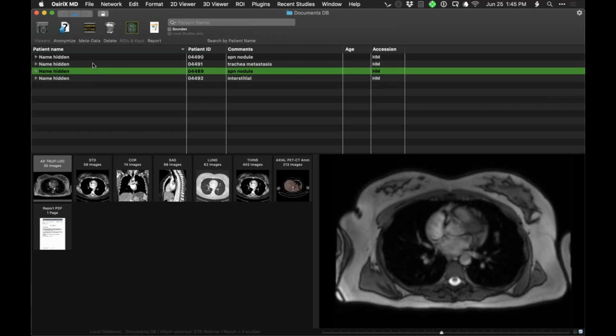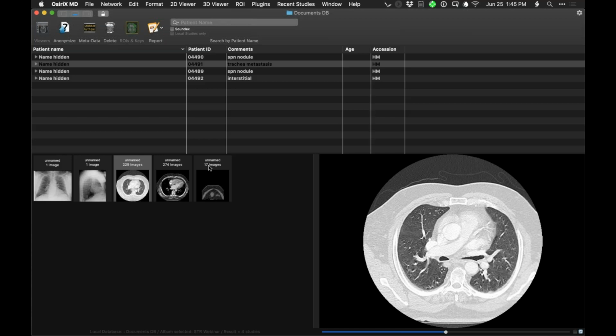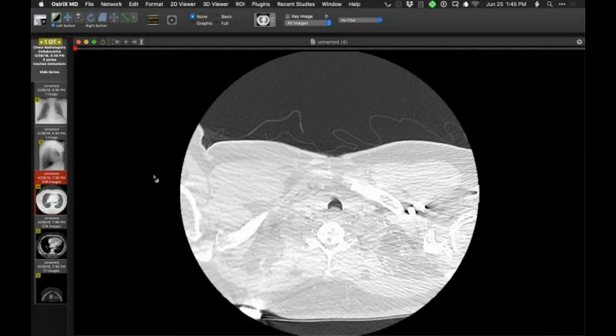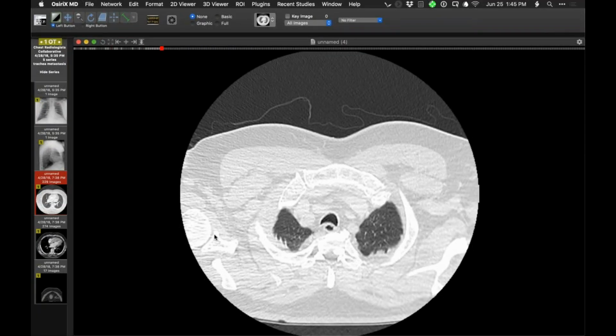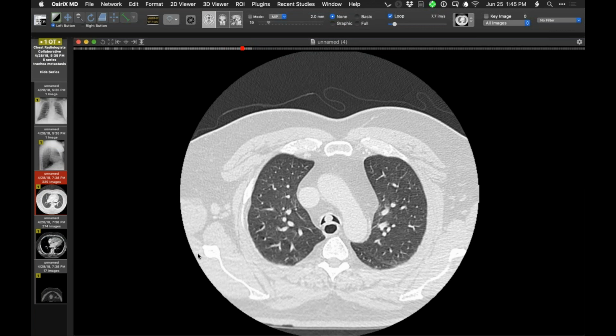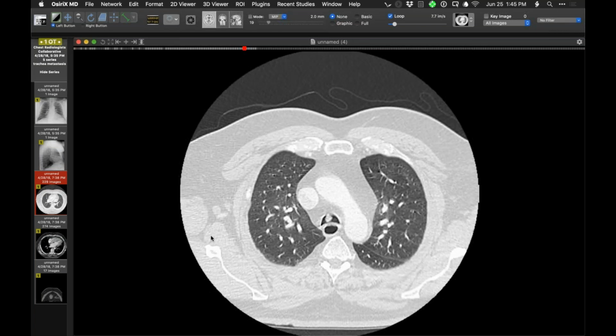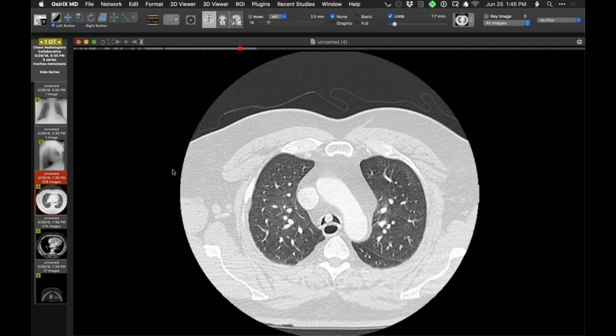This next one is just a curiosity. The chest radiograph I'll go right by because we will not see this. And one could readily go by this as well. So this will be the differential diagnosis for a small nodule, well circumscribed in the trachea. And in this person, he does have a malignancy. It is a clear cell carcinoma of kidney. And that's what this is. So it's a solitary metastasis. They took that out, and the patient has done quite well. So metastatic tracheal clear cell carcinoma of kidney.